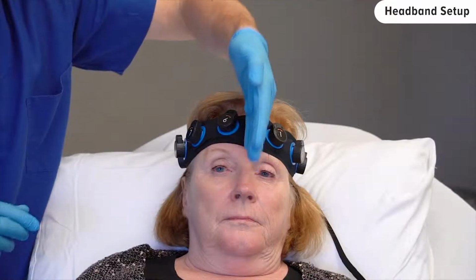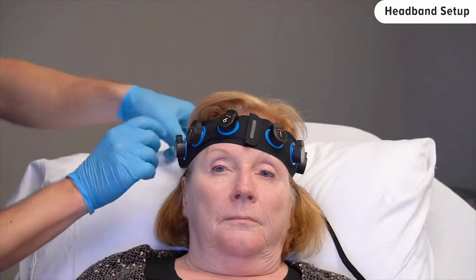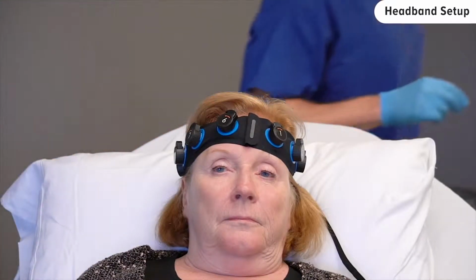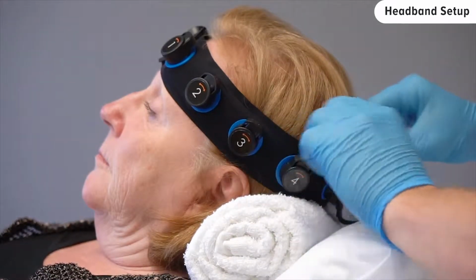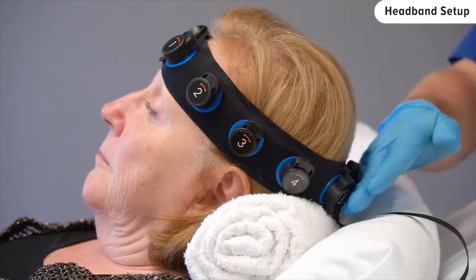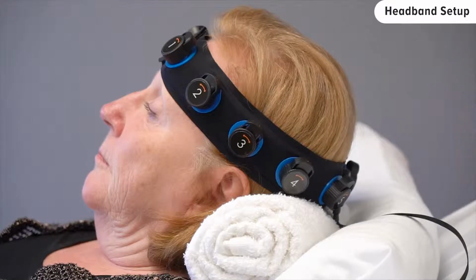Make sure the headband is centered on the forehead and positioned right above the patient's brow line. It is best to untie ponytails and move bangs out of the way of the headband. Slide the rear portion of the headband down so that it fits just above the ears. Ensure that there is space between the back of the headband and the pillow for less pressure.